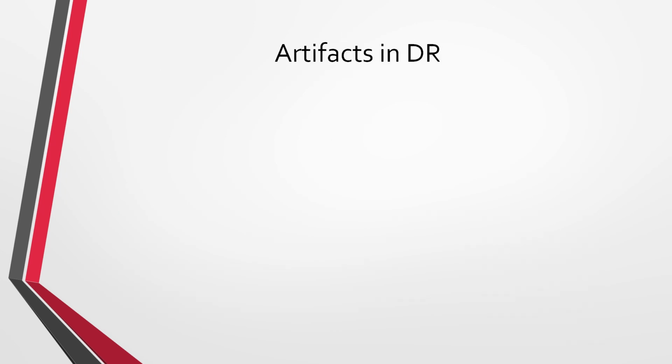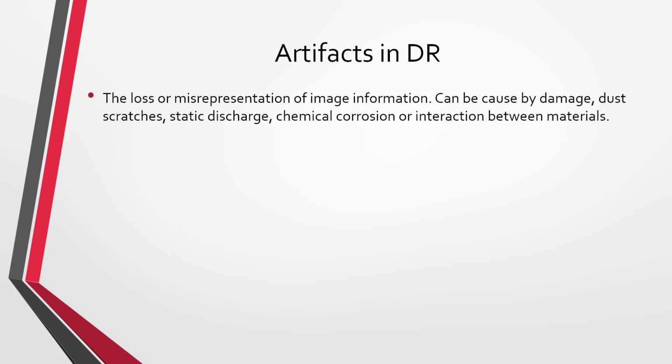We'll go ahead and talk about some artifacts in DR. For a more complete artifacts lesson, on the QA playlist there's an artifacts video, I believe it's the third video. We'll talk a bit more about artifacts in DR here. The loss or misrepresentation of image information is an artifact.